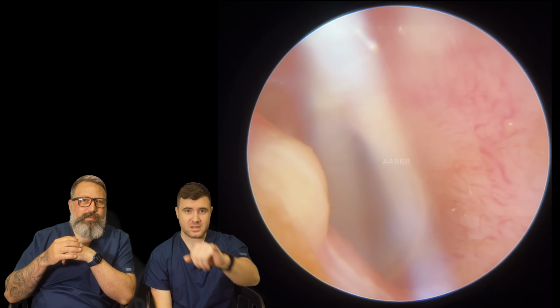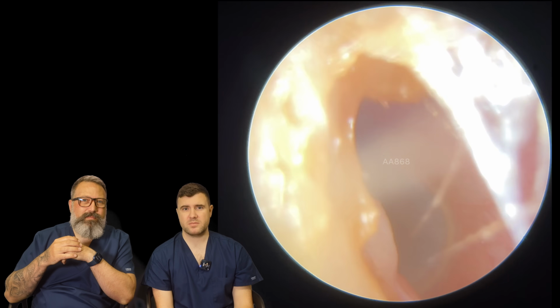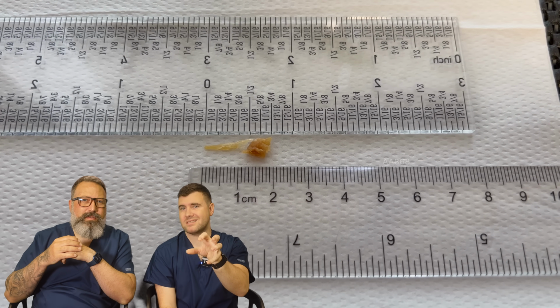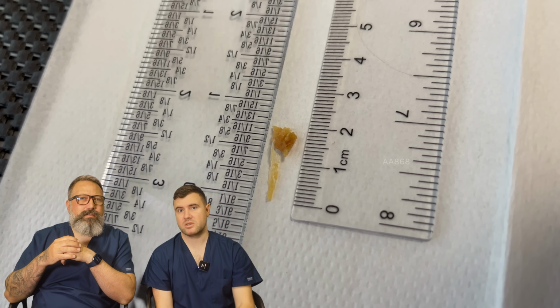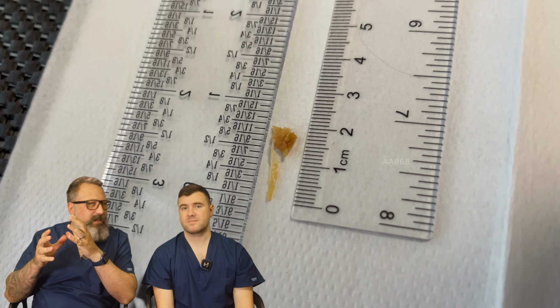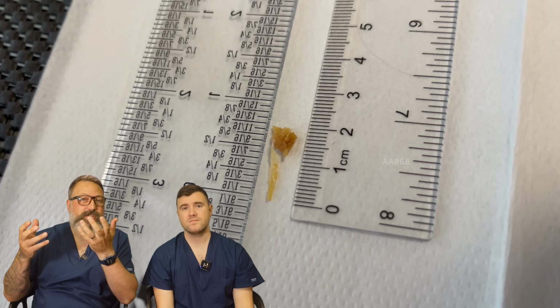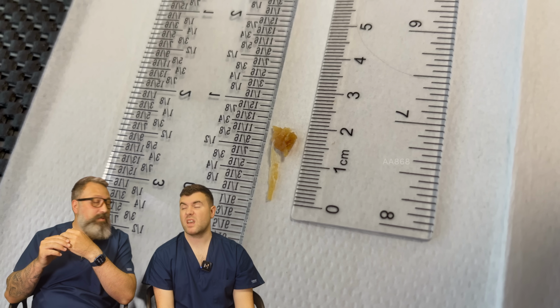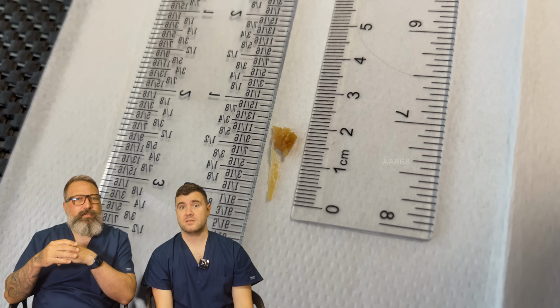You can see we've got a very tiny little bump on the ear canal there, so we've possibly got a little bit of exostosis going on here. I don't think it is though. No. But yeah, we would have told the patient that we would have kept an eye on it. You can get these little benign lumps and bumps just sort of knocking about in the ear canal. There's nothing untoward going on there. People just get them. It's like as soon as you get lumps and bumps on your skin and places, it just happens. There's nothing to worry about in there. We've got another, just under 2 centimeters. I'm going to go about 3/4 of an inch on that one.